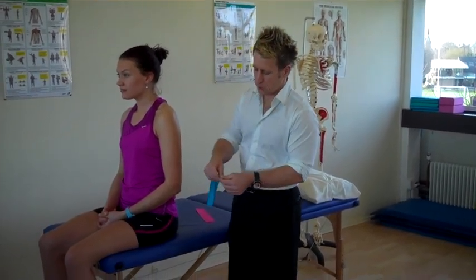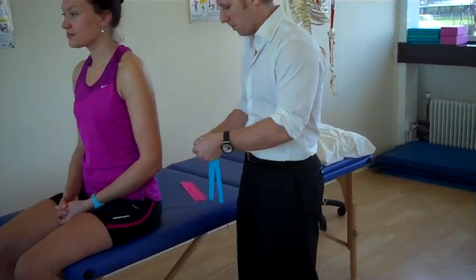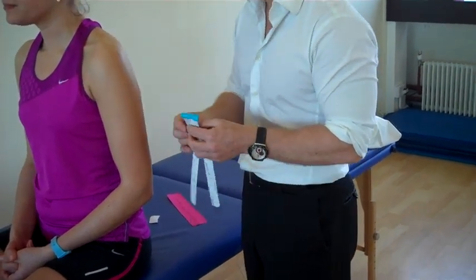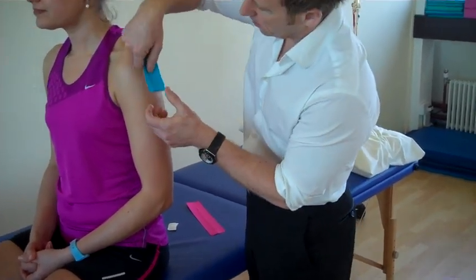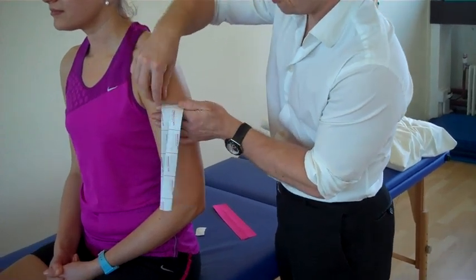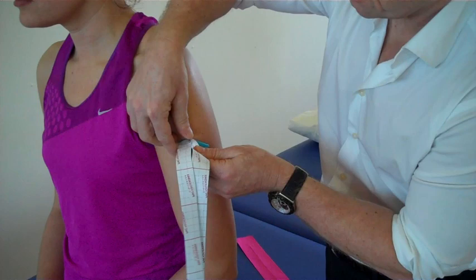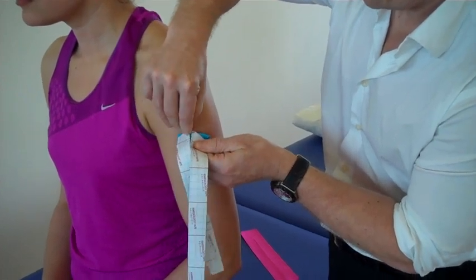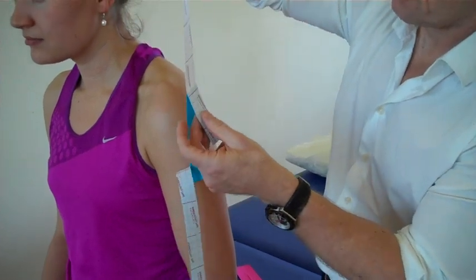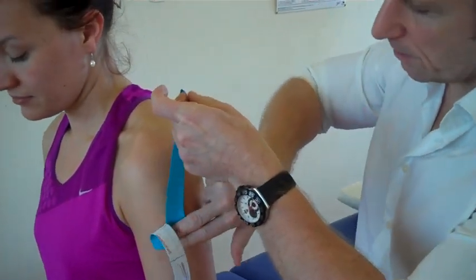So first for the tape: we split the tape towards its end where we have no stretch on the ends. Where the deltoid comes down to the insertion of the tuberosity, we're going to apply the first piece of tape onto the tuberosity with no stretch. Then we use one of these lugs — or legs if you want to call it — and feed off. We'll do one at a time, making sure that's sticking on there.